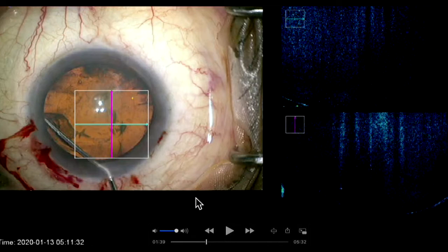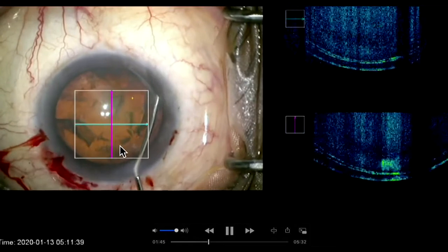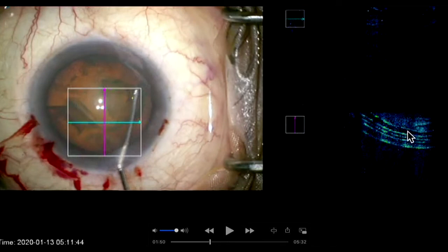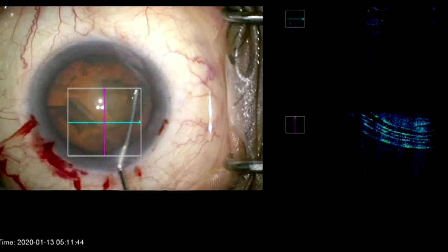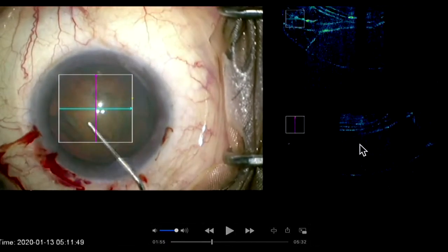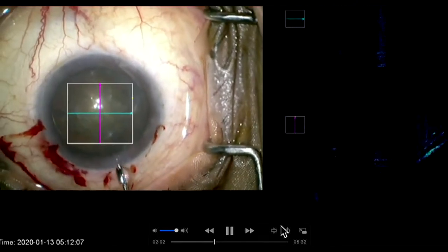You can see the fluid wave going through and reaching completion — this is the completion of hydrodissection. Take out the fluid from this area and from the sub-incisional area. On OCT you can see the delineation has happened — this separates the nucleus from the cortical complex, creating multiple planes of delineation. The cortex will remain as support to the posterior capsule during nucleus emulsification, which is important. You need a good dissection to safeguard your posterior capsule. See how beautifully the delineation has occurred, and the large amount of fluid that has been injected. Compression from the side will decompress the fluid, and decompression of the anterior chamber is important before initiating phacoemulsification.